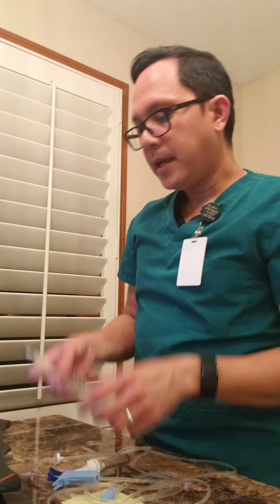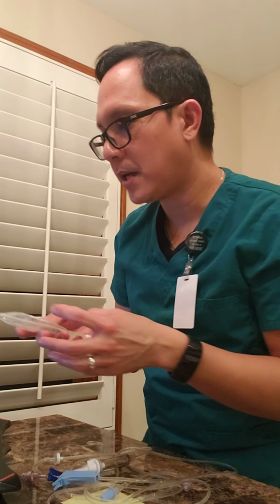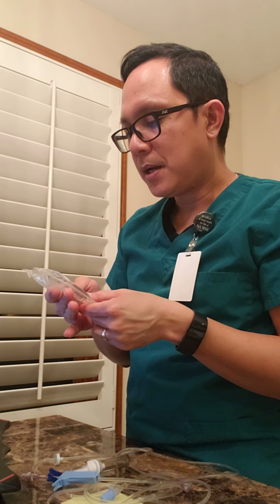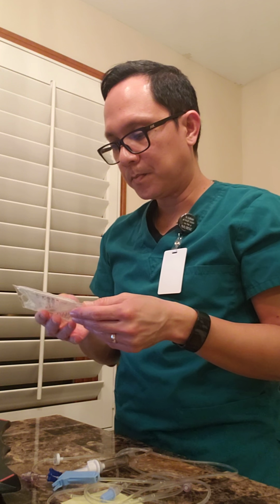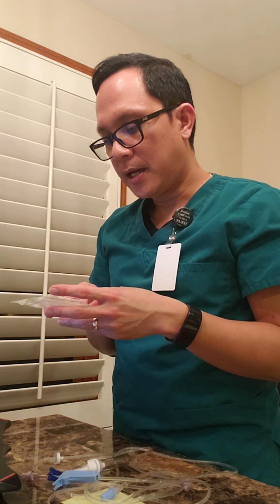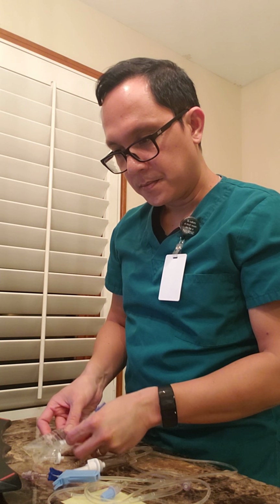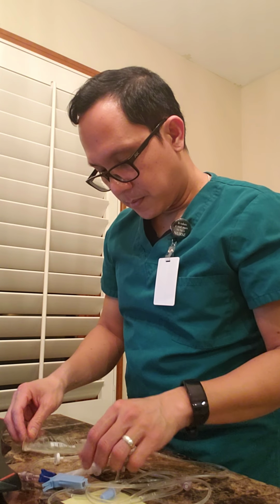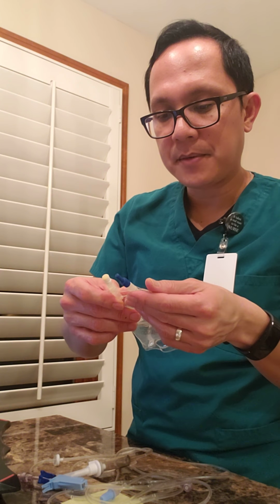Before I connect the spike to my bag, I want to do my second check. I want to make sure it's the right medication by comparing it to the MAR. I want to make sure it's the right medication, the right dose, or the right volume for the right patient, the right route, and the right time. Today, I'm going to be giving my patient a 0.9 sodium chloride as per doctor's order. Now I'm ready to open and take the protective covering or cap of my IV bag.